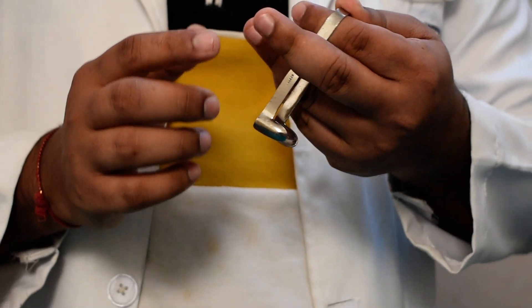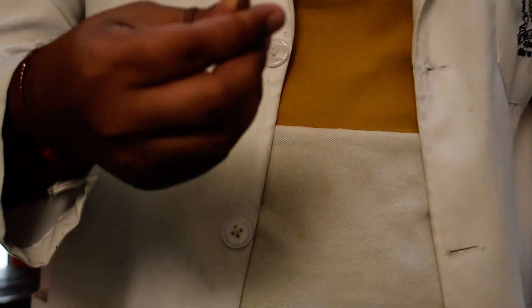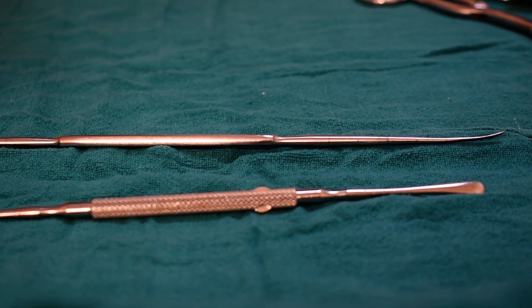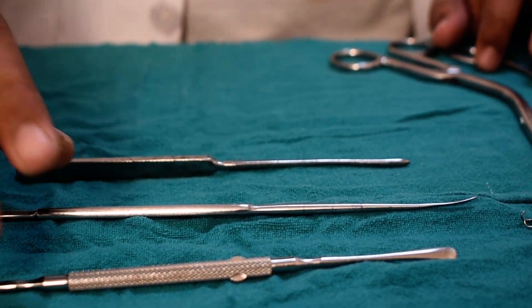This is Cottles — it is used in raising the flap, just like the Frears elevator. You can see this is the Frears and this is the Cottles, and they have the same function. This is a nasal elevator, but in our centers we don't use this; we use these two only.